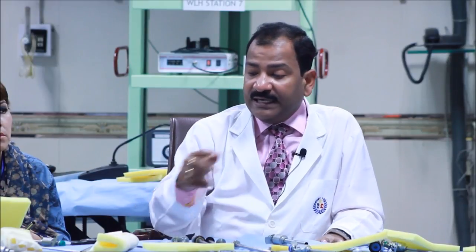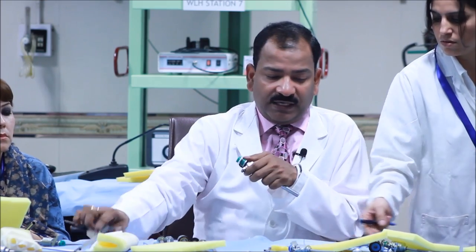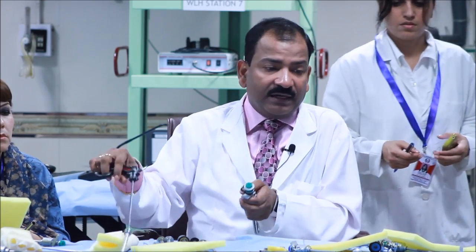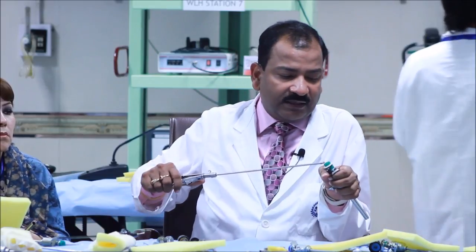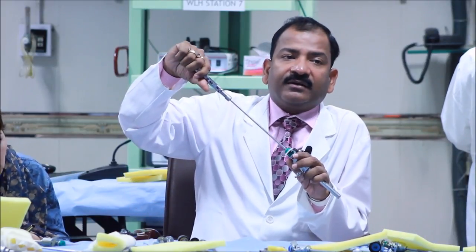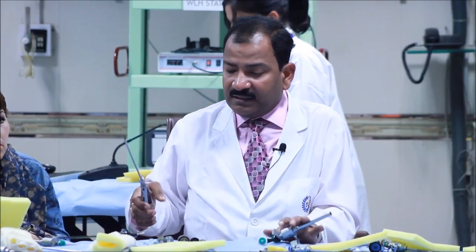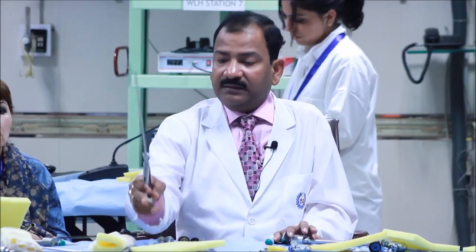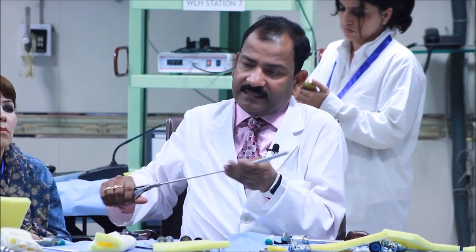Sometimes I have to put a needle inside for suturing, knotting. This cannot be used. If I use a top mounted reducer, I cannot put a needle. Suppose there is a needle holder and I want suturing. If I hold it like that, I cannot go. See, it will touch, it is trapped here, it cannot go. But if I have a long reducer, I can put my needle holder first into the reducer like this.